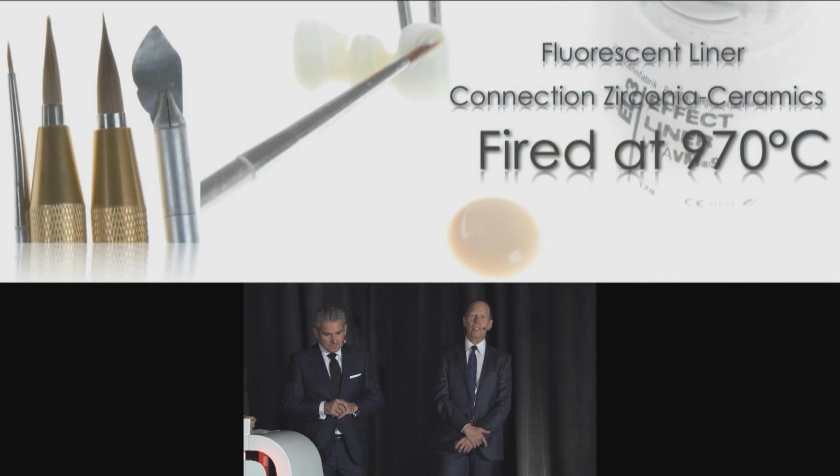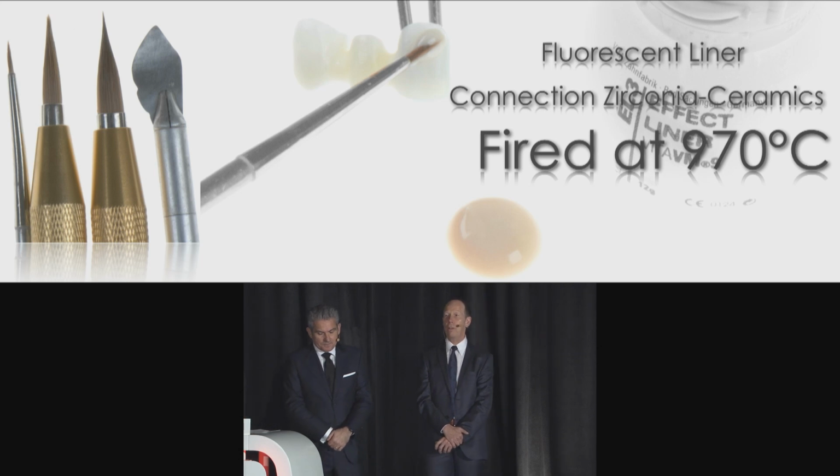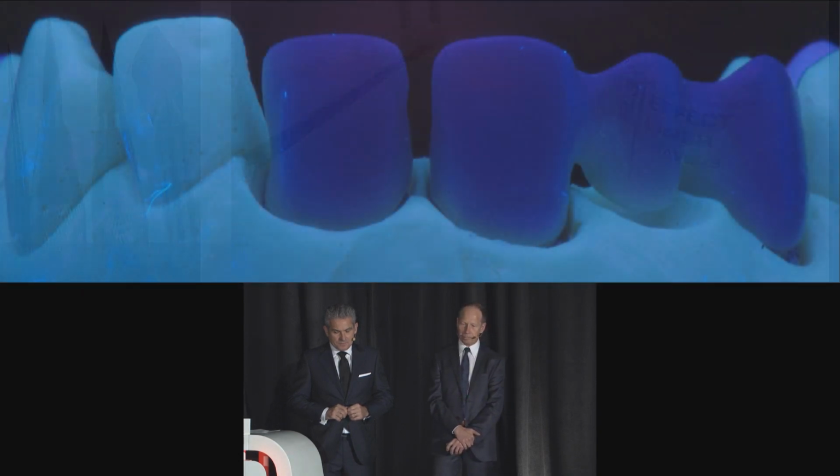And then of course, this is a little bit of chemistry. This is what we learned from the industry, that we have to ensure a good bond, a good connection between the zirconia substructure, copings and bridges, and the ceramics. So we go up, we fire extremely high for the first firing. It will be a wash layering, very thin, and this ensures us a good connection.